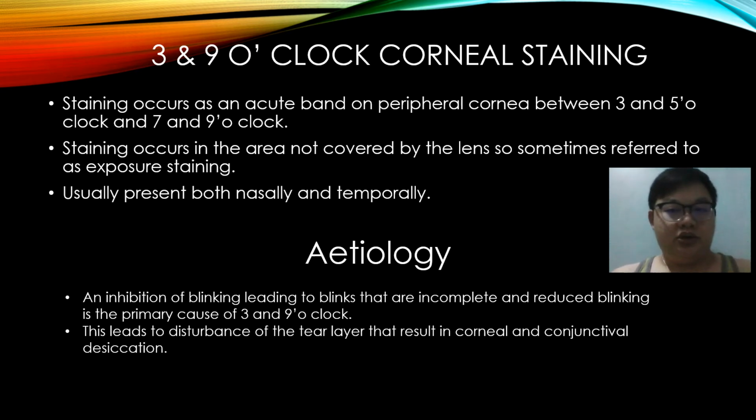So the etiology is an inhibition of blinking, or incomplete blinking by the patient. Reduced blinking is the primary cause of the 3 and 9 o'clock cornea staining. This leads to disturbance of the tear layer that results in cornea and conjunctiva desiccation.